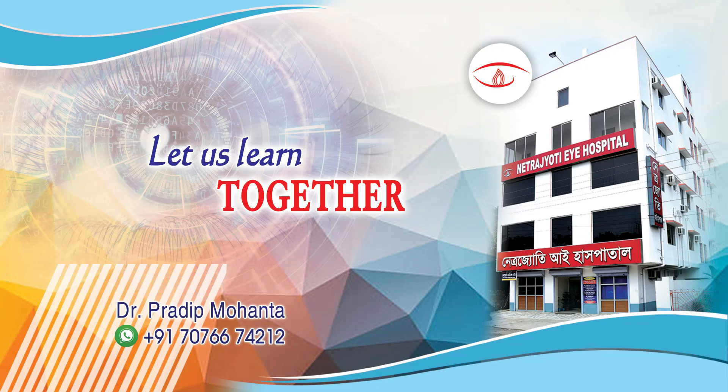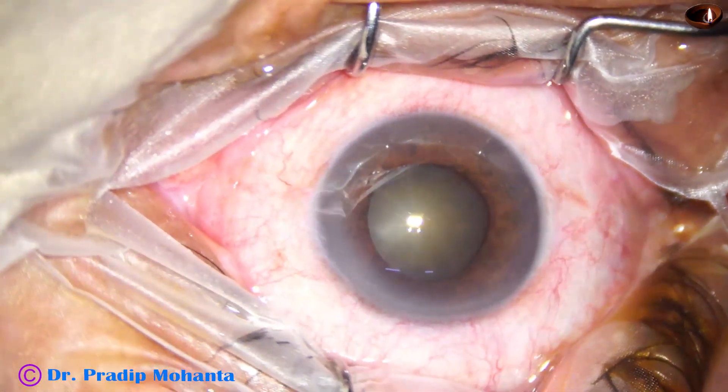Welcome to my workplace at Ranakhart, West Bengal, India. Let us observe this minimally edited surgery.